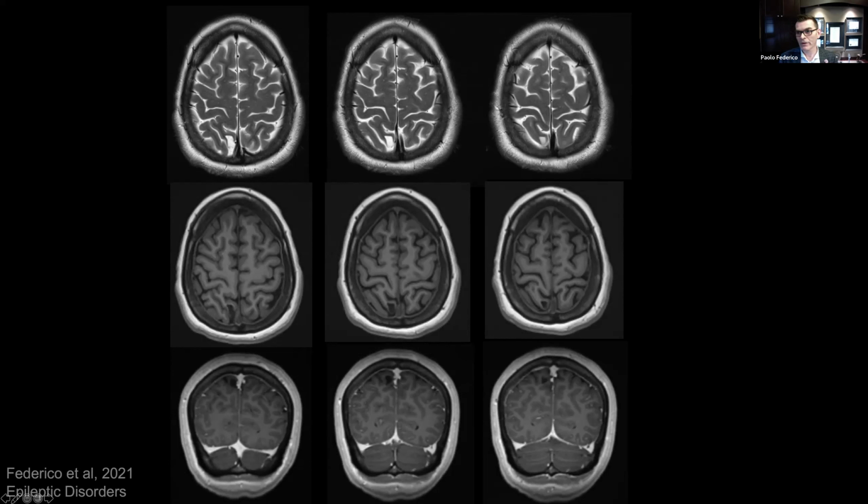And this patient actually underwent epilepsy surgery during the same admission with us because she came from out of town, and she's now seizure-free. Sorry, I guess I should have asked for a differential, but it was actually a DNET. And she was having these seizures since the age of 6, and she was told that her MRI scan was normal. This is probably a tricky area in which to identify a lesion. If someone is scanning through the MRI scan, they won't think to look at the vertex here. But we had a very strong suspicion, and we looked at this. And the lesion was present in the previous MRI scans, which we obtained.